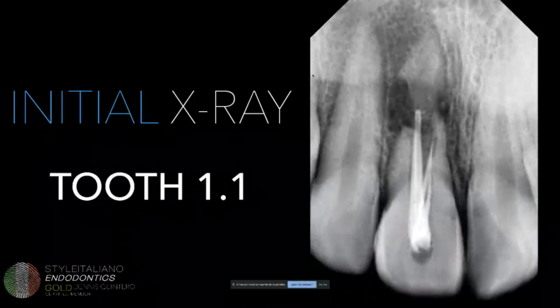Okay, so when I took the periapical X-ray, as you can see right now, of course, you can see the end of treatment is not the best. You can see all the gutta percha these colleagues left behind in the pulp chamber, on the coronal part, and also it's very obvious the resorption that this patient has on the root. Also, a big lesion in the periapical area that you can see.